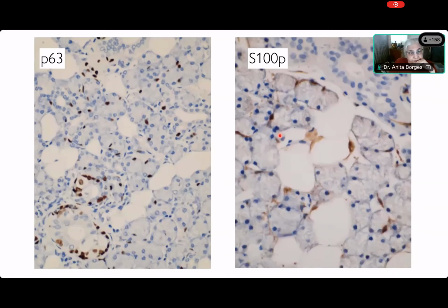All right, here we have the famous P63. Now, P63 is expressed in myoepithelial cells. You couldn't see the myoepithelial cells at all when you were looking at it in the H&E. But see how many myoepithelial cells you can see here around the acini. You can see them in some of the smaller ducts, and you can certainly see them in the abluminal cells of the big ducts. This is just the beginning of a striated duct over here, and you can see that's the outer layer of these ducts.